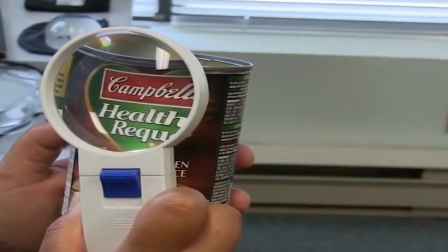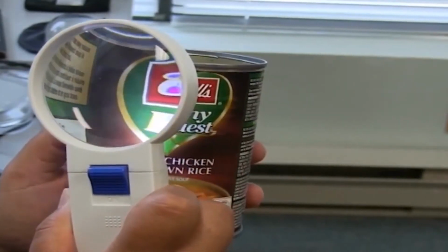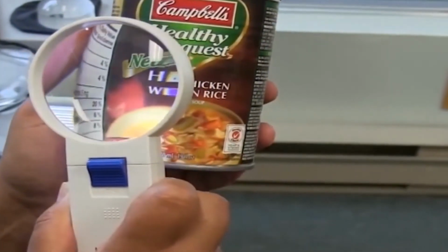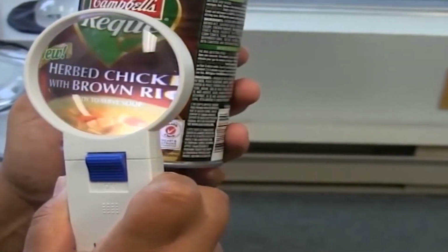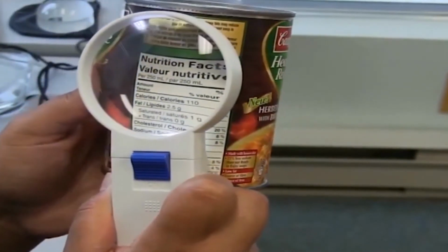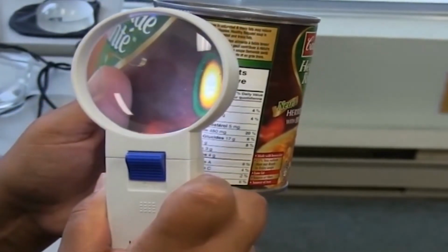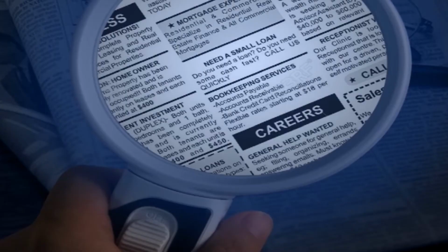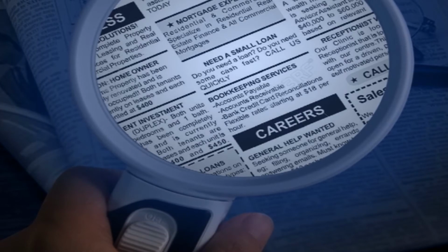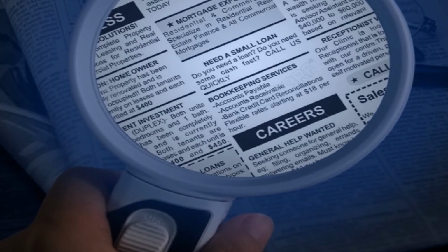How to use it? The reading material has to be kept at a comfortable distance. Then the magnifier is brought near to the print and gradually moved in towards the face till a clear image is seen while trying to read the text through the magnifier. This is the best distance to read the text. One should try not to change the distance between the magnifier and the text till the reading is complete.